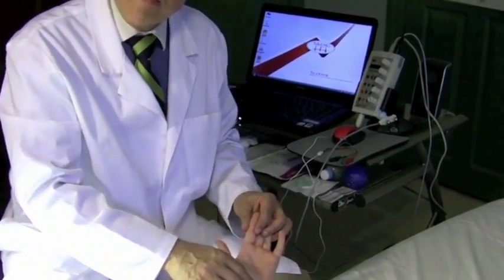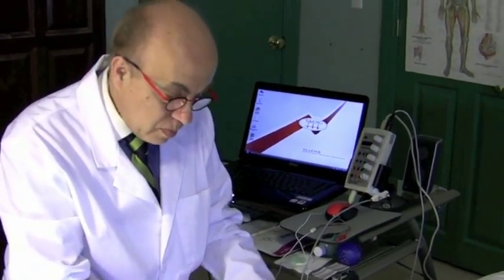So it really doesn't matter where you stimulate. Actually it does, but what matters most is where you record from, because that's what is going to determine if you're studying sensory or motor fibers.